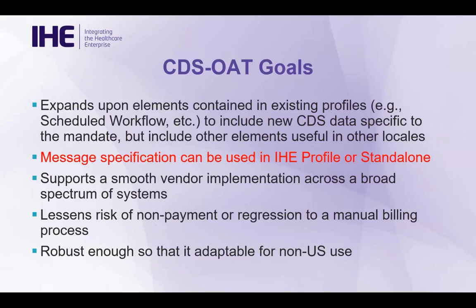So this profile mainly augments those existing messages, especially all the HL7 messages, with an OBX segment that specifically communicates the information related to clinical decision support.